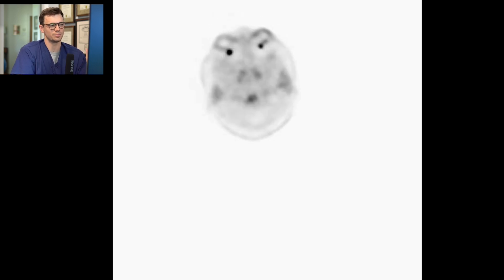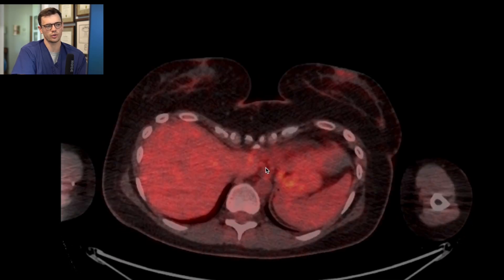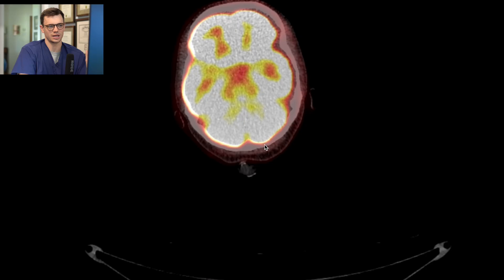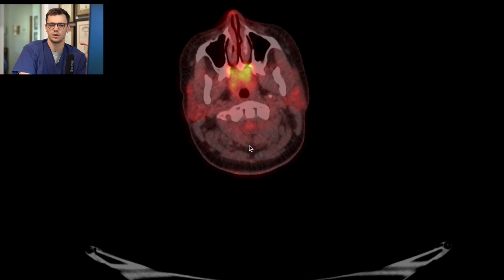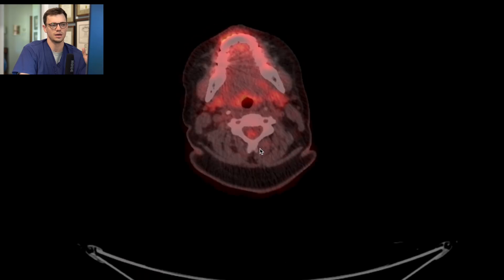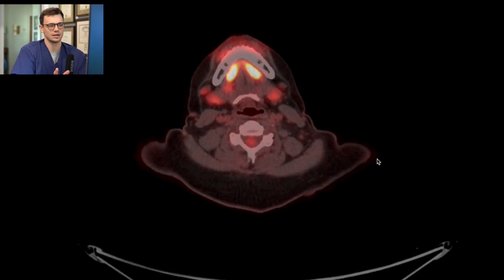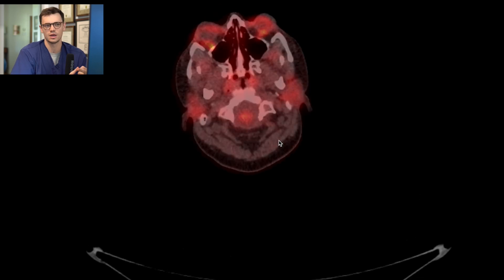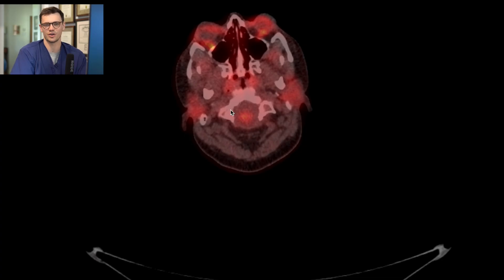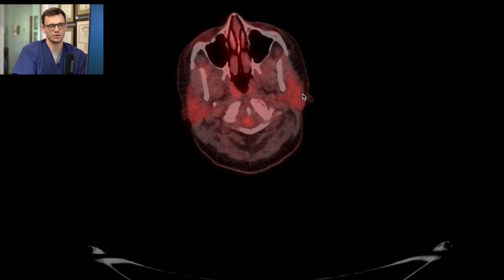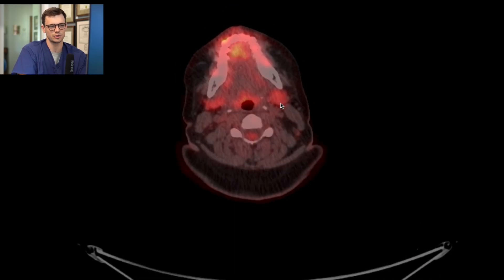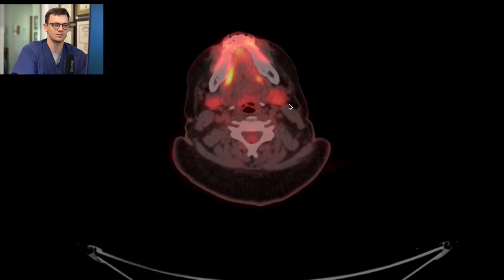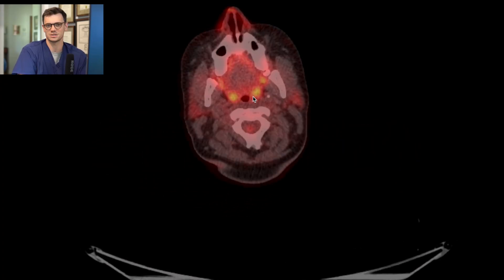After looking at the brain on my PET images, I pull up the fused PET-with-CT component and go all the way to the top. I start head to toe. Now I'm looking at the neck using the fused images. The main pathology in the neck in many cancers is lymph nodes — lymphomas, head and neck cancers — and you're looking for cervical lymph nodes. In this case this is normal; there are no nodes taking up too much tracer. If you see a node that's really hot or really big, that's pathologic. I also pay attention to the parotid glands, submandibular glands, sublingual glands, and the aerodigestive tract, making sure there's not a squamous cell carcinoma.